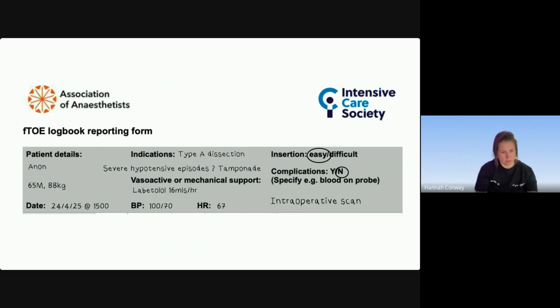There was some evidence of thrombus around the aorta, but there was certainly no evidence of tamponade, and our concern was that the patient was tamponading, which would obviously cause a slight concern in terms of getting the patient operated on quicker.